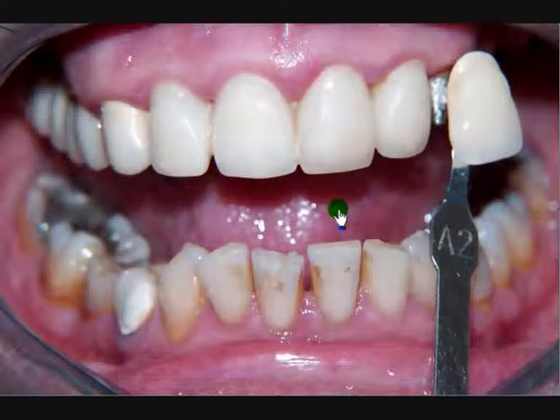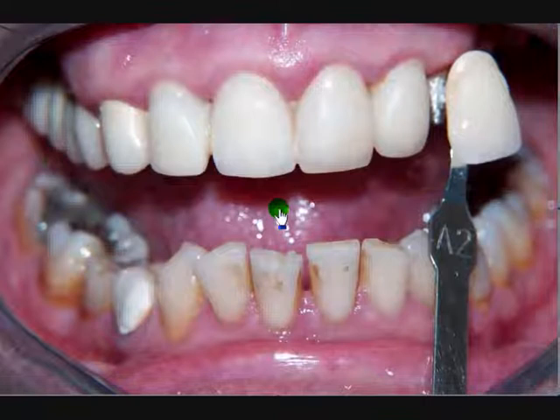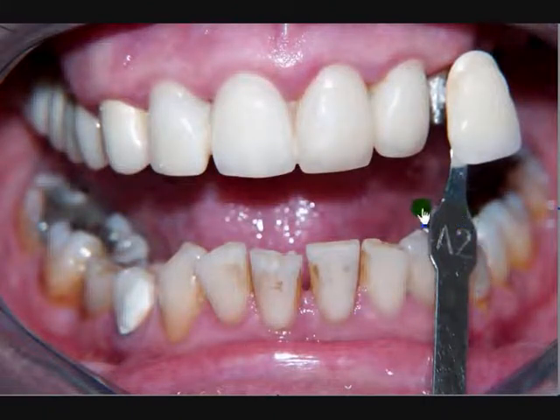But the first thing that appears so evident is this A2 shade tab, which belongs to a Vita shade tab, next to this existing bridge, followed with this A2 Vita shade tab.